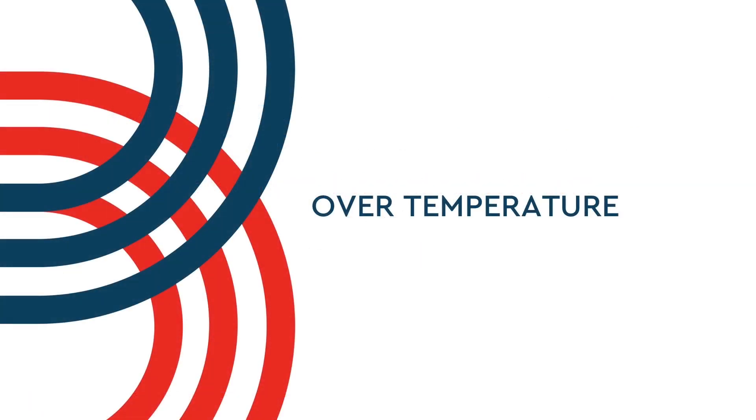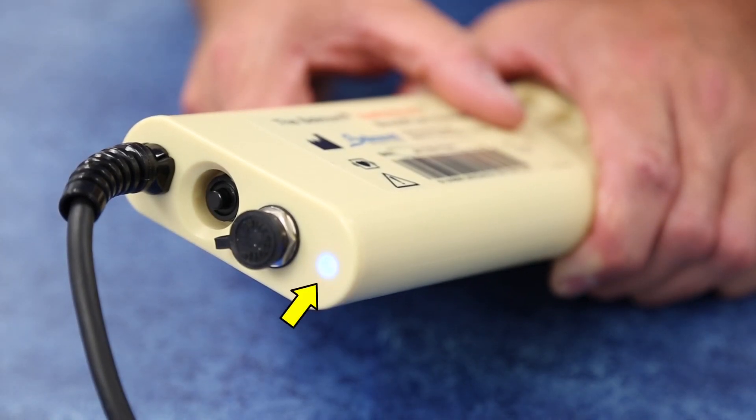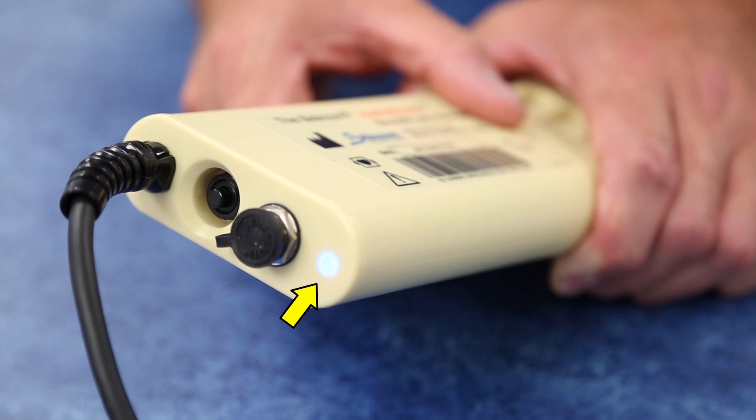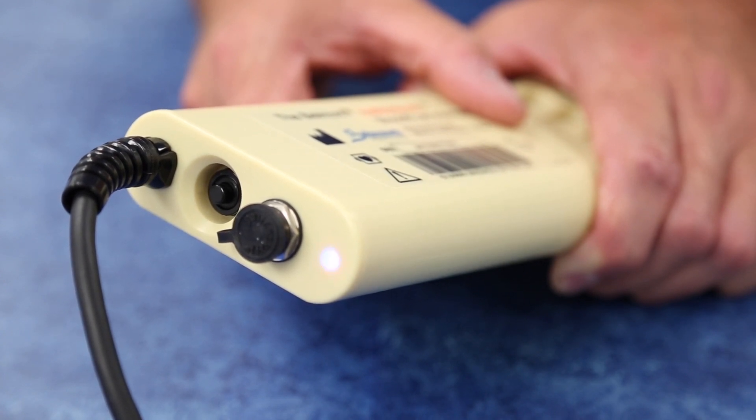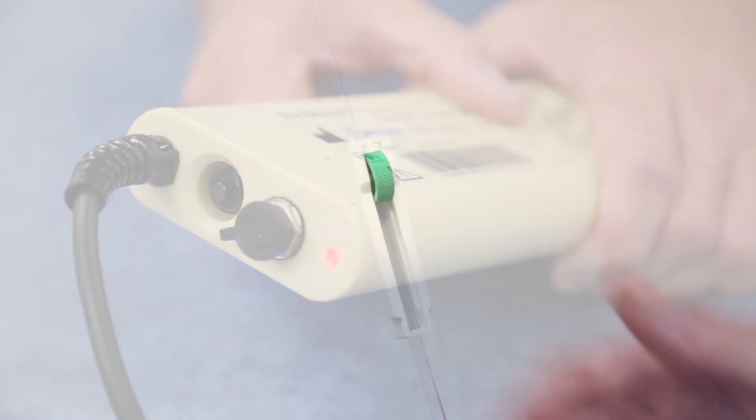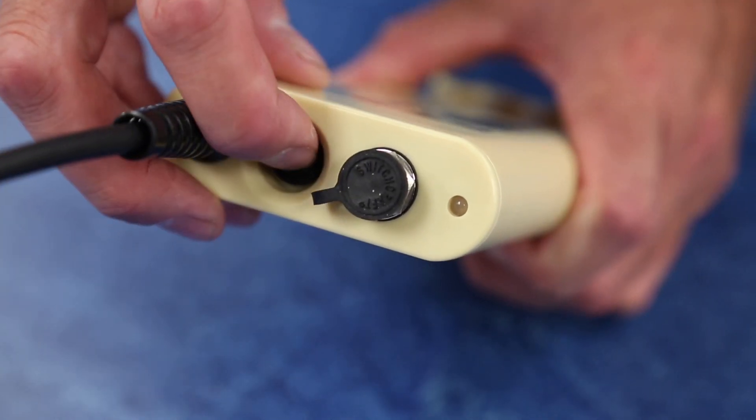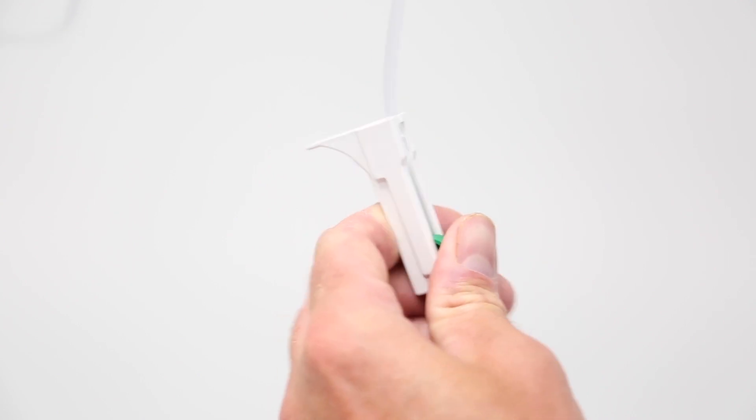If the system detects an over temperature, the system will stop heating, blue and red LEDs will flash, and an audible alarm will trigger. An over temperature alarm may be triggered by repeatedly stopping and restarting infusion during high flow conditions. To resolve the condition, clamp off the line and repower the system by turning the unit off and then back on. Unclamp the line to restore flow.